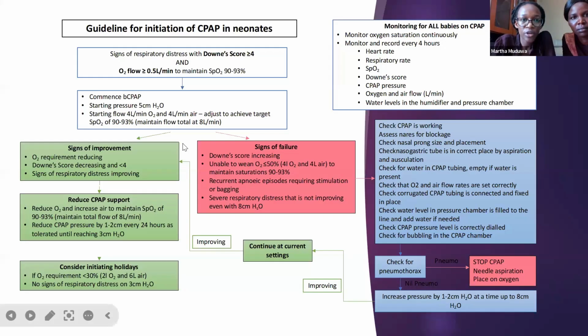As suggested, I think it's safe to say that everybody does it slightly differently. We saw from Dr. Amir's presentation it was 6 to 8 centimeters, but in answer to that question, maybe we could just share the protocol that is used in Mbale about the pressures and the FiO2 that we start on and how it's adjusted. So how do we start the pressures?